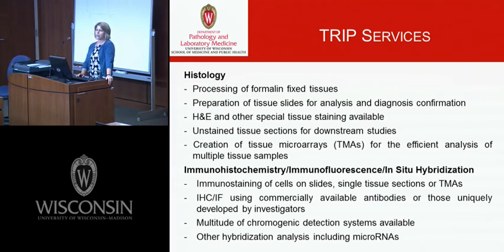We then provide other additional methodologies for investigators, such as immunohistochemistry or immunofluorescence or in situ hybridization. We can do these staining techniques on cells that have been fixed on slides, on single tissue sections, or on TMAs.